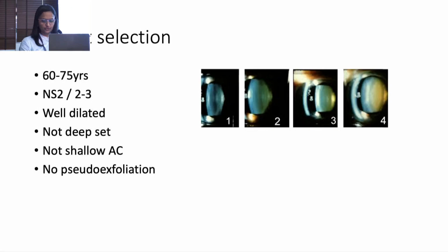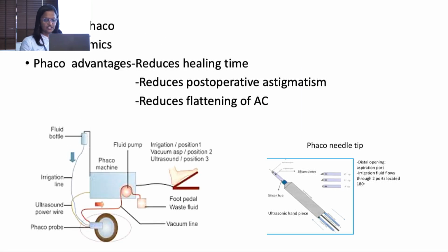The advantages of phaco: we are shifting to phaco mainly because it reduces healing time, the postoperative astigmatism is less, and the AC is better maintained.